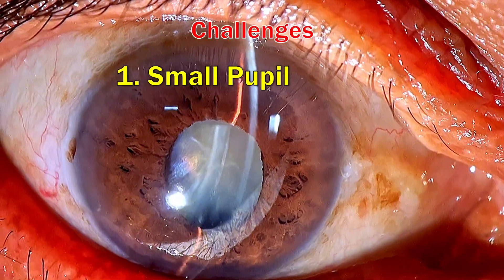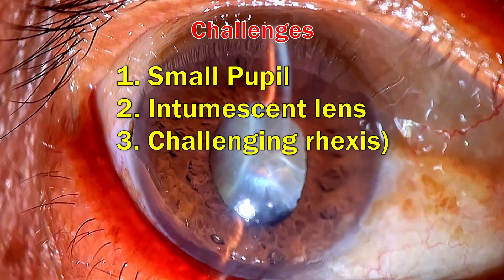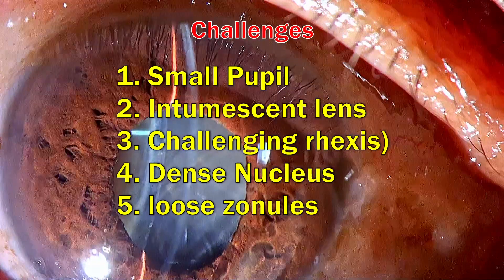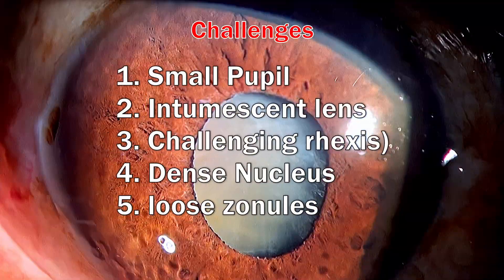We have a smaller pupil to deal with. We have an intumescent lens, so the rhexis could be challenging. Underneath this, I expect a dense nucleus looking at the color of the cataract. And lastly, I am also expecting loose zonules in this patient. So I am aware of all these complexities and let's see how things turn out.